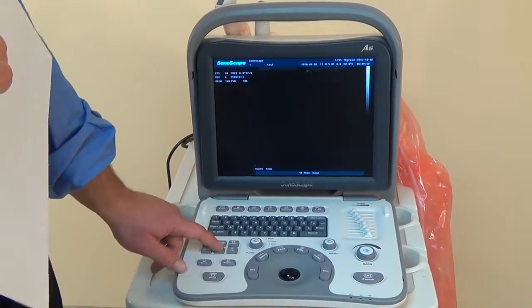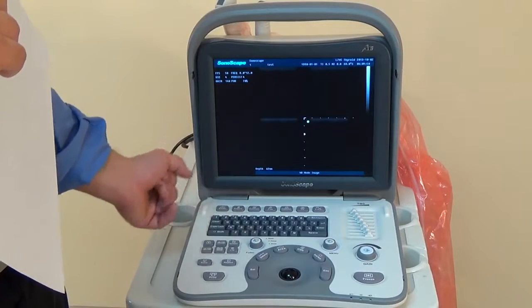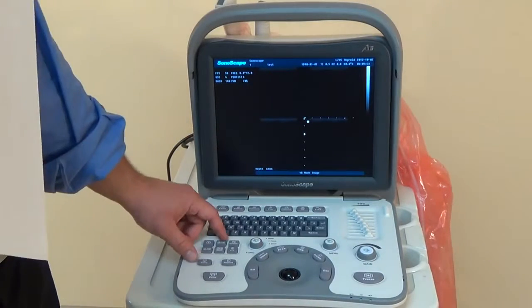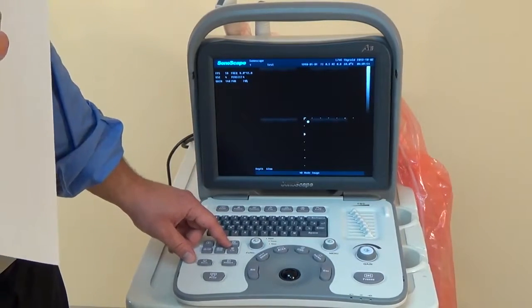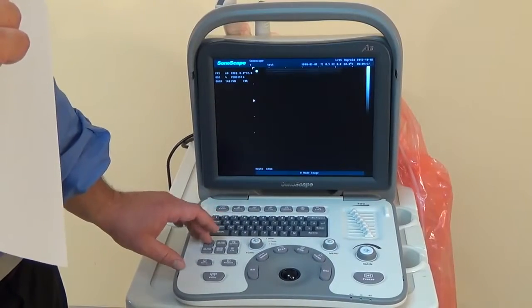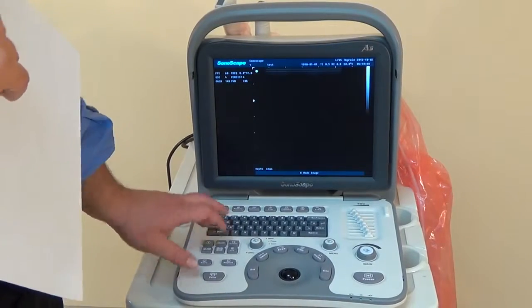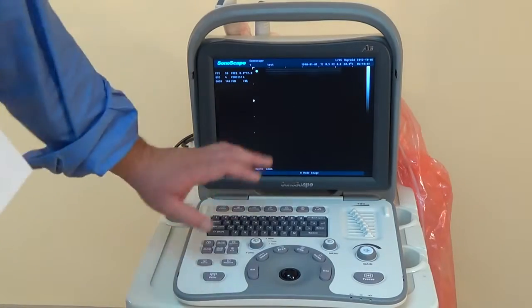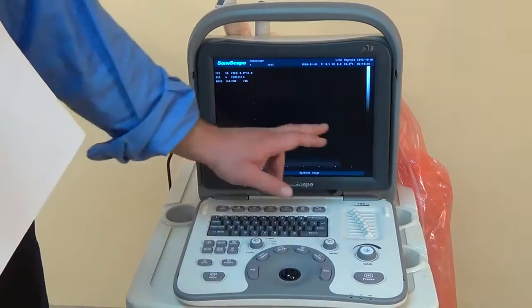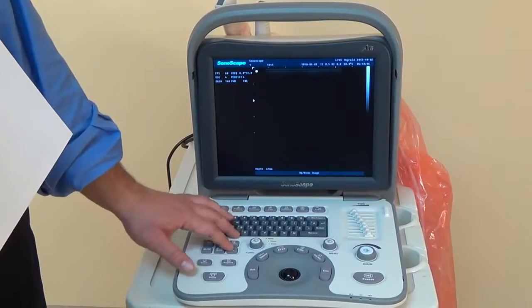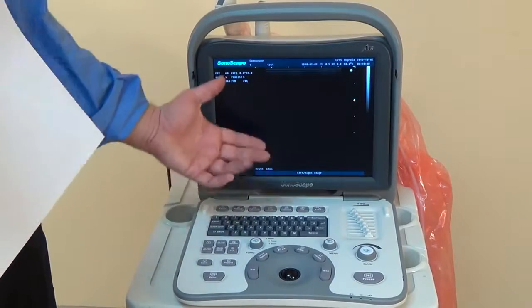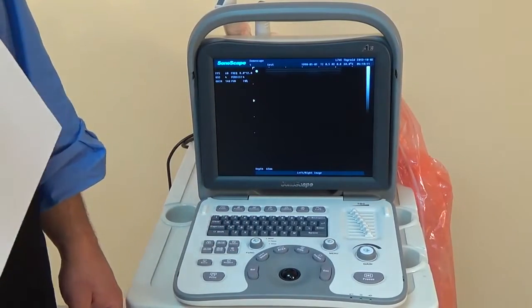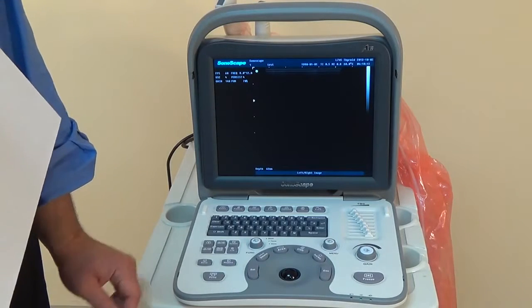Another one is a four-way screen. If you're comparing something that's sometimes popular, you probably won't use that too much. And then there's the ability to do up, down, and left or right. So depending on the type of positioning you're in or if you're in a tricky spot, sometimes you have to put the machine or operate in a way where you might want to flip the orientation. So whether that be upside down or left or right, that's a user preference. Most people usually don't touch those, but it is available if you need it.